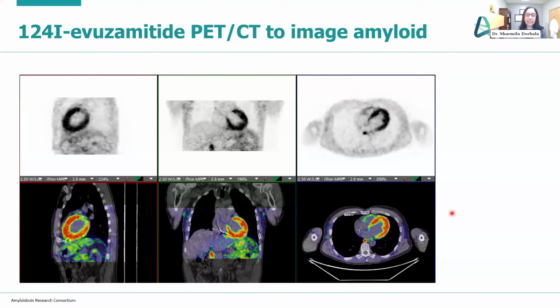Whereas at the earliest clinical suspicion, you could consider an imaging test. And if that's negative, you could be reassured that it's unlikely to be amyloid and you pursue other investigations for the symptoms. Or it could be positive, and as seen in this case, then you could perform selective biopsy only in people who have an abnormal PET test suggesting amyloid in the heart.